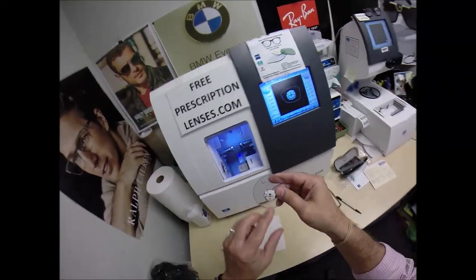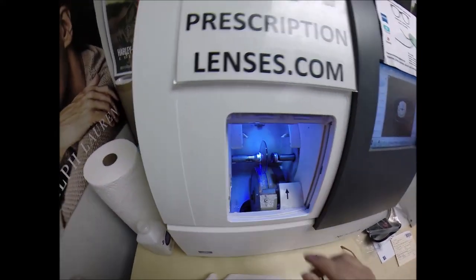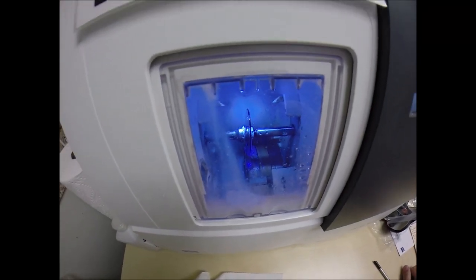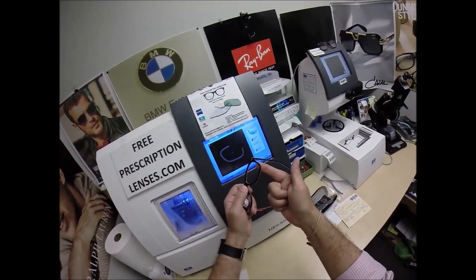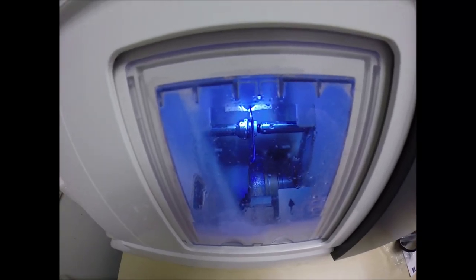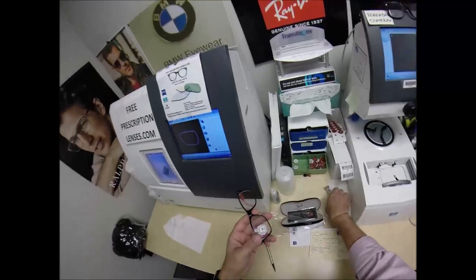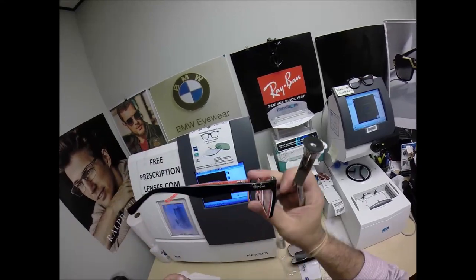I'm going to place the magnet into the chuck — or I'm going to call it the Jayla and the Camilla. Hit the start button just like before. The door closes — it's a little bit cleaner this time, Secret Agent 2840. It's going to be traced again by the two white styluses, making sure it's large enough to fit into the left side of the frame. You can see it going around tracing the shape of the left side, and measuring the thickness at every point to know where to place the bevel so you have the least amount of edge thickness showing — of which you've got no edge thickness, Victor.